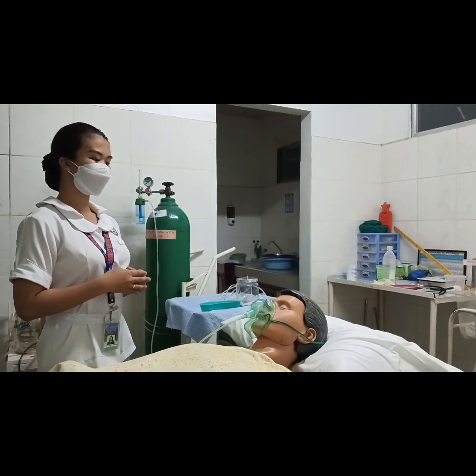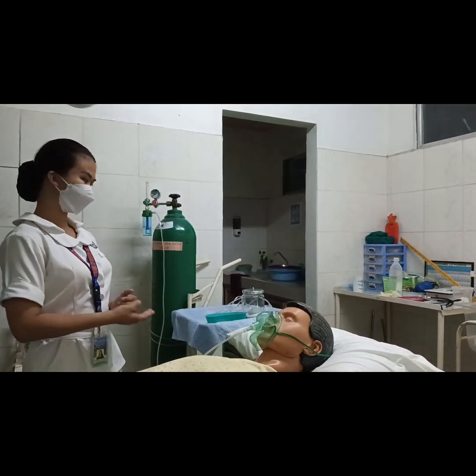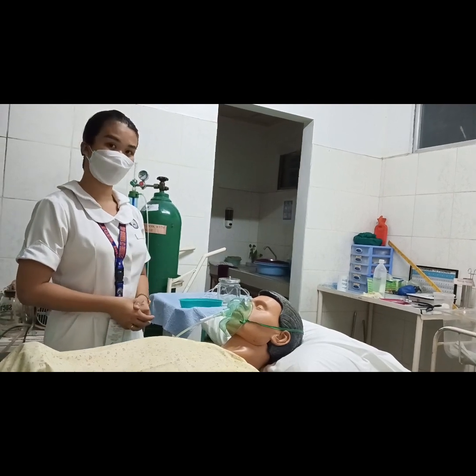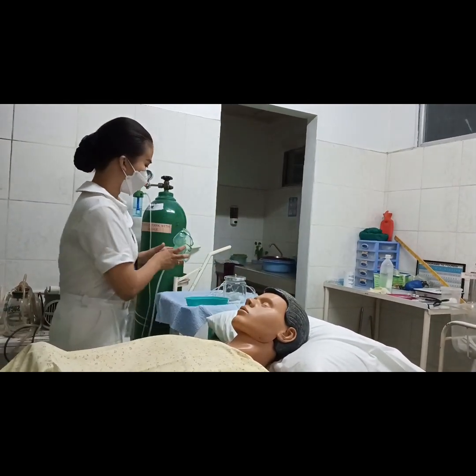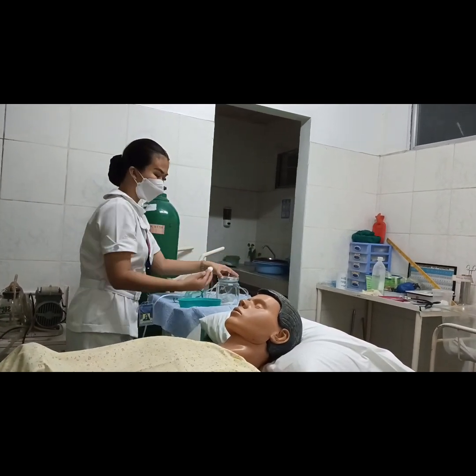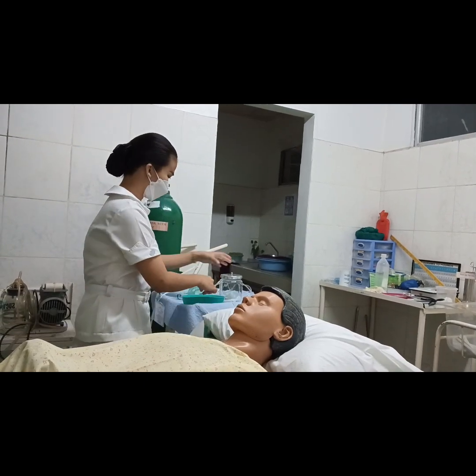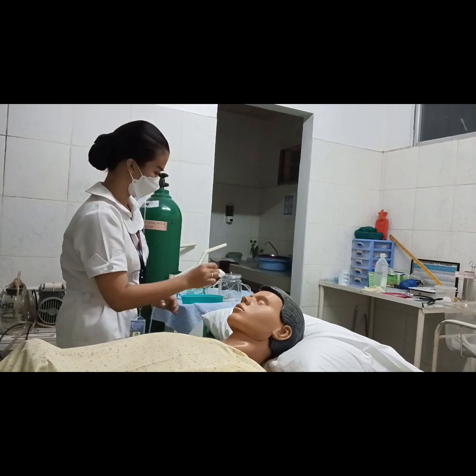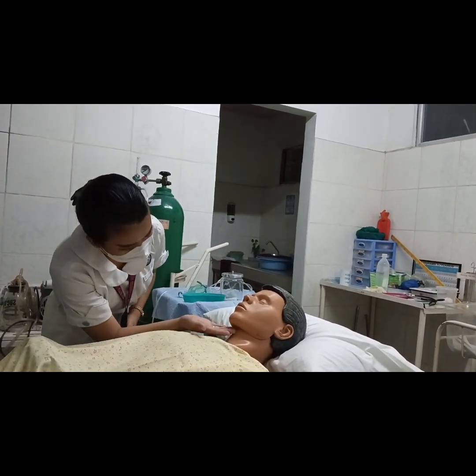I will stay with the patient for a moment to observe his response to the treatment. I will remove the mask every two to four hours, wipe away the accumulated mist, and assess the underlying skin.